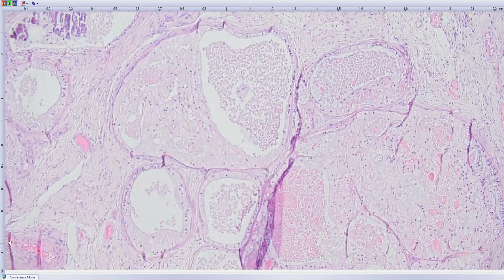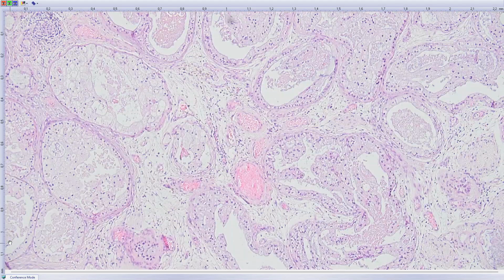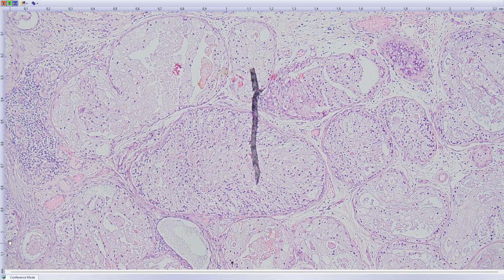Oh, it's prostate, yeah. Thank you. So, okay, it's a metastasis, it's also prostatic carcinoma, but you ruined my story. So, a 70-year-old man. At first, it is improbable to have a germ cell tumor at this age.